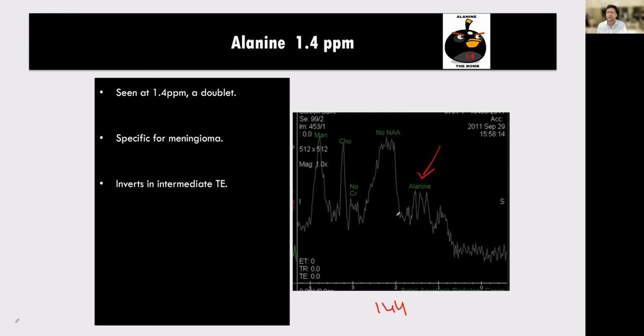And we don't run spectroscopy for meningiomas most of the time. If you consistently run it, maybe in 100 cases of meningioma, in around 50 to 60 cases you'll definitely see the alanine peak. If you sit in a viva with me and your case is on neuroradiology, I will definitely ask this question about what is the peak seen in meningiomas.